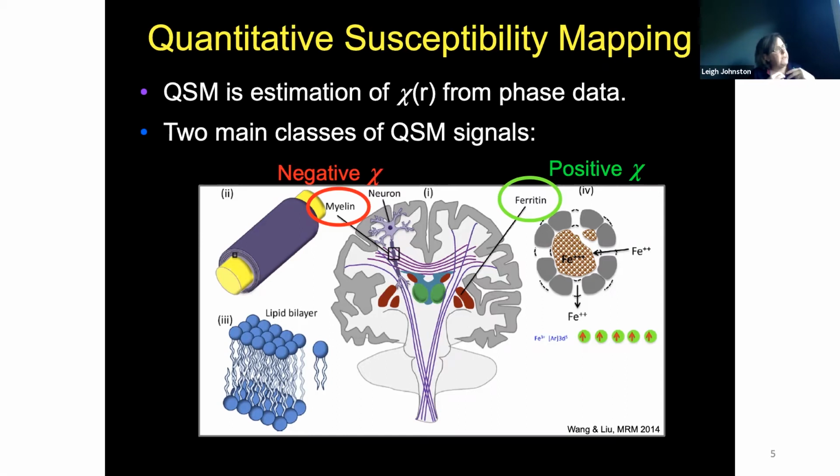Sometimes it comes back, sometimes it doesn't, but it's like unwrapping a piece of copper wire and having all of the data just disperse into the environment rather than being picked up between the repeater stations that are neurons, if that makes sense. It slows down the conduction, and it means that the signals are not being transported efficiently around the brain if there's no myelin. So QSM, while people are excited about iron, people are also equally excited about the potential to distinguish where there is iron accumulation and where there is myelin degeneration.